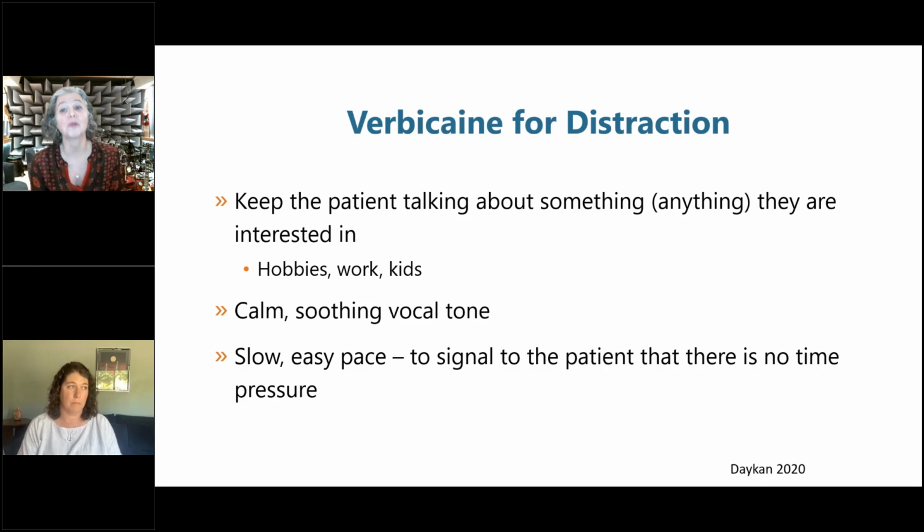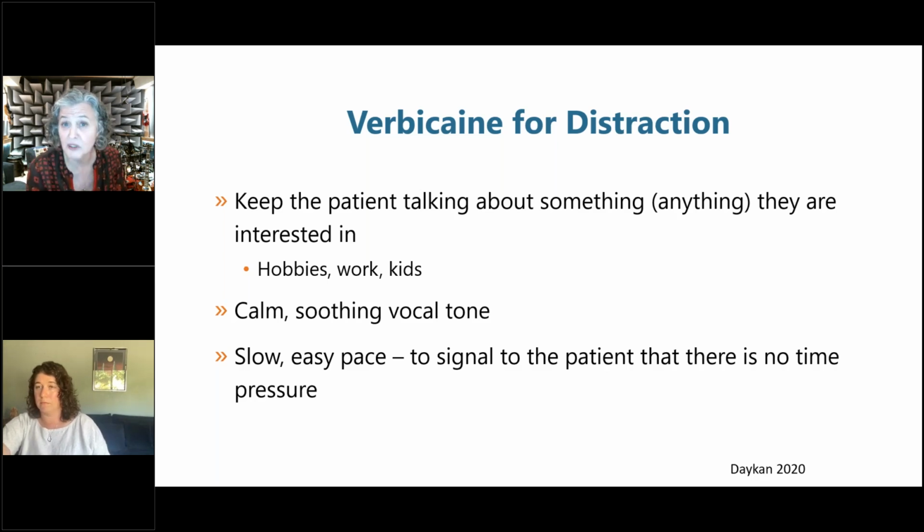I've had some really fascinating conversations with people while they're having their IUDs placed or their cervices biopsied, while they tell me about the wild things that they are doing. But they may not want to talk at all. So this is really only for the person that's giving you a response indicating that they're open to a conversation. And they may at a certain point experience pain and stop talking. And it's really helpful to say, we can pause for a second if you like.